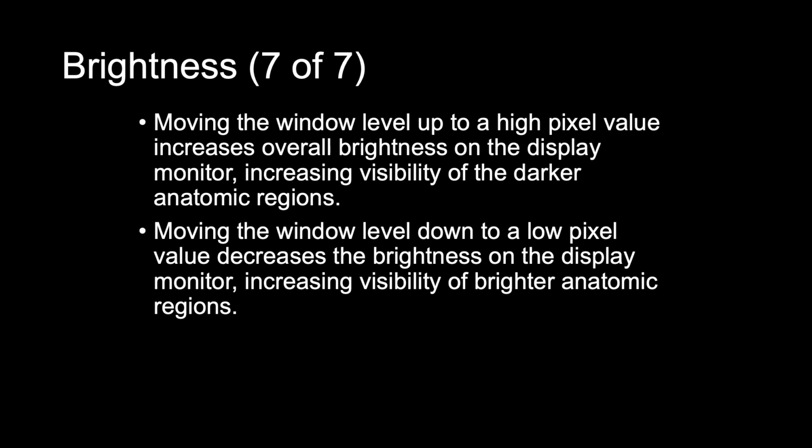Assume that pixel values from 0 to 2048 are used to represent the full range of the digital image densities or brightness levels. So it goes from 0 all the way to 2048. So a high pixel value all the way at 2048 could represent a volume of tissue that attenuated fewer X-ray photons and is displayed as a decreased brightness level or increased density.